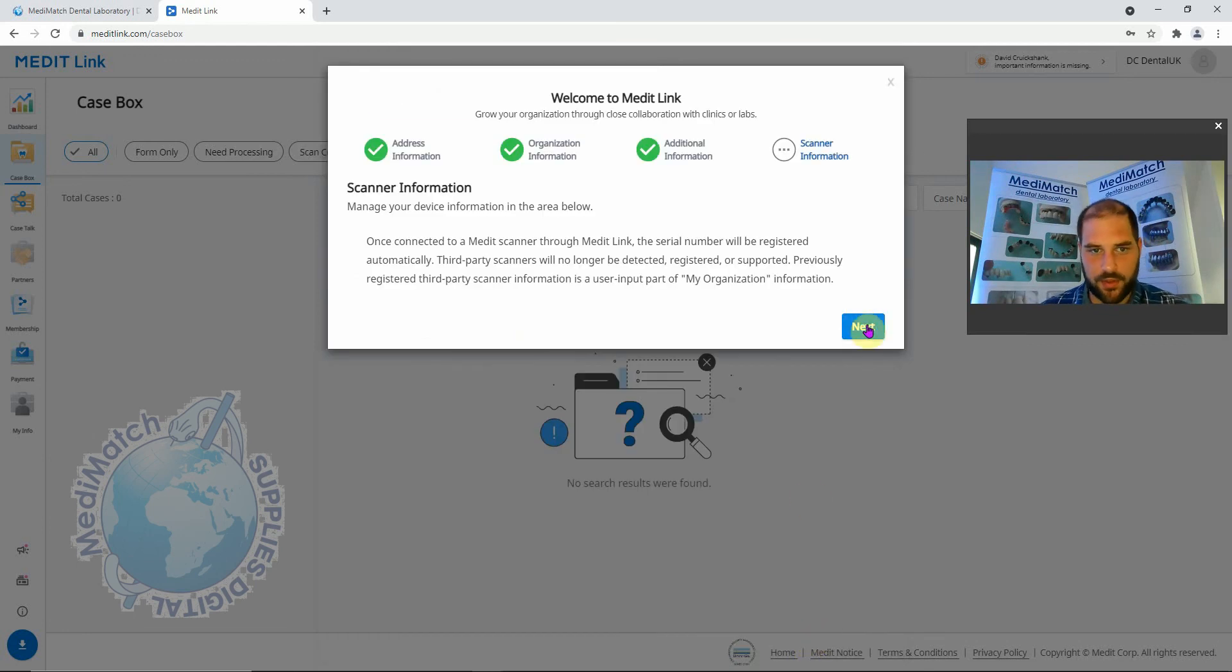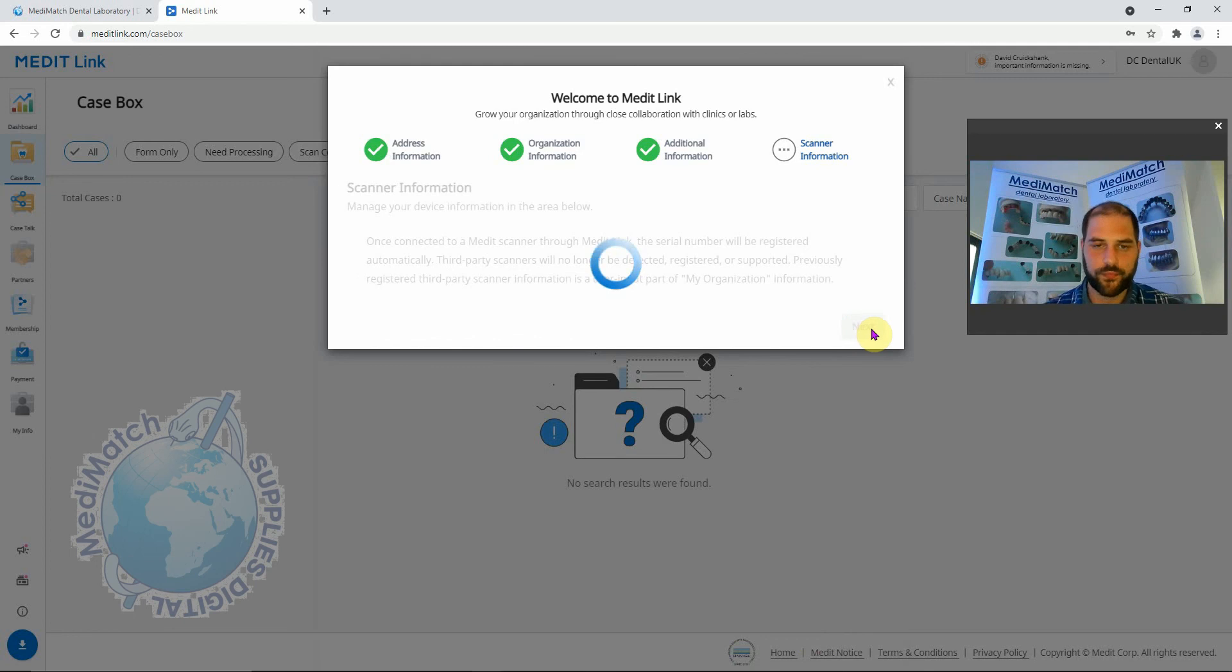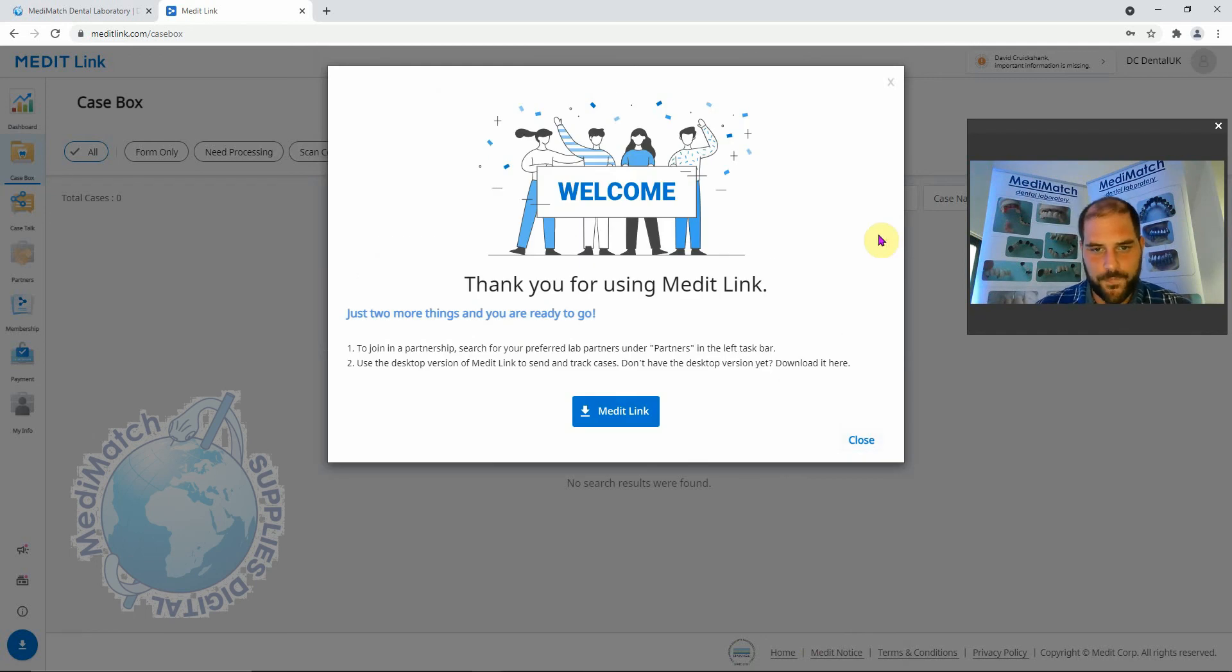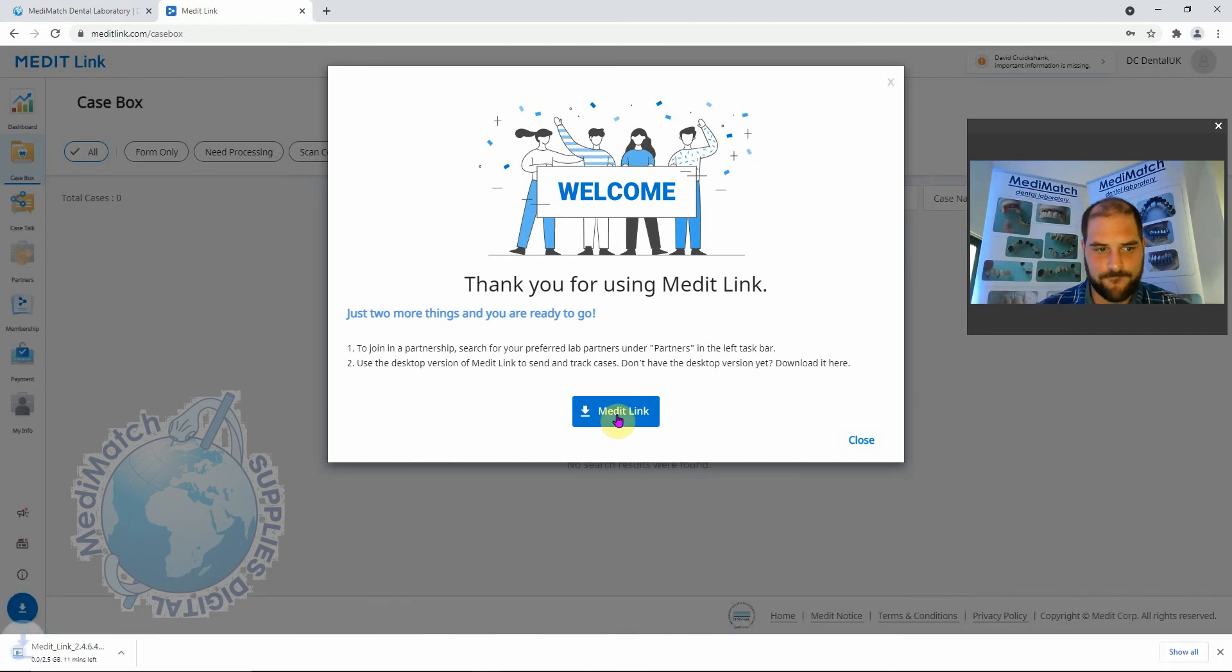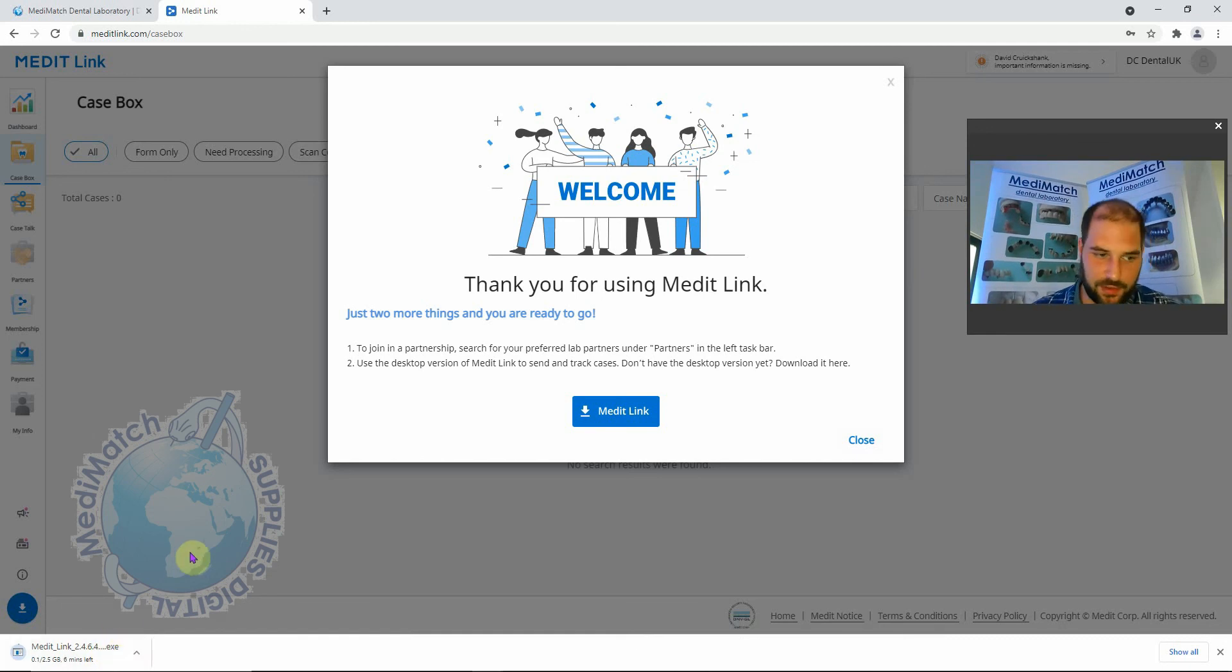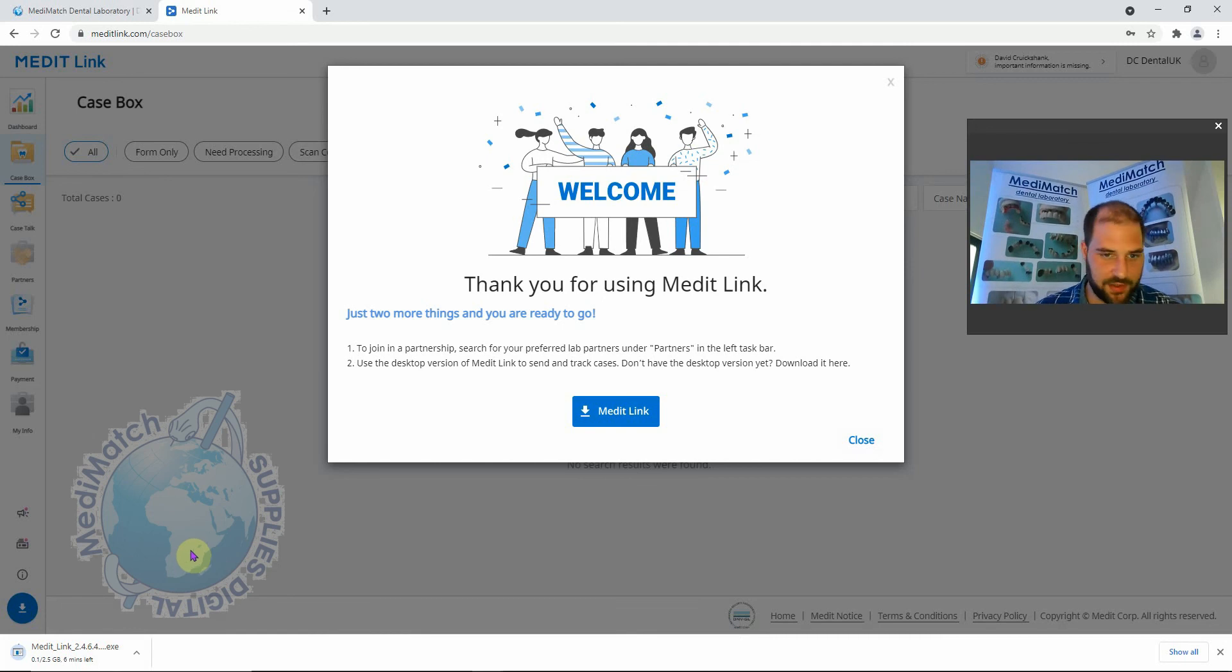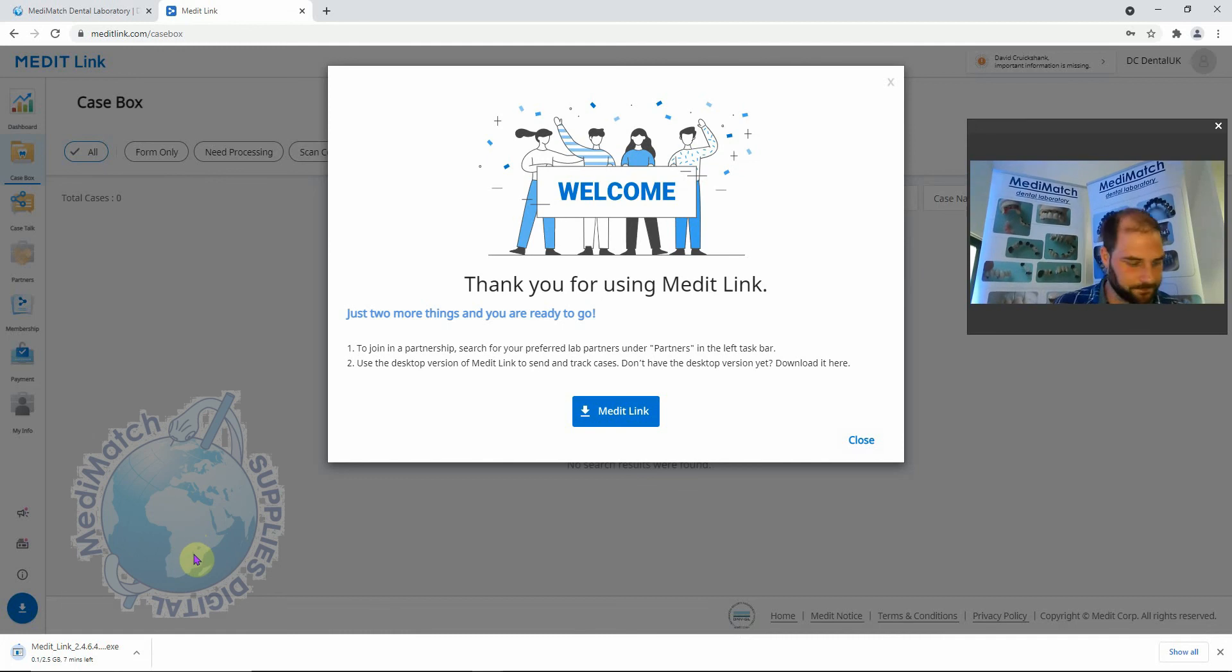We're pretty much done. We can now click on this icon here to download MediLink. That's just started off the download for the latest version of MediLink. It usually takes around 5, 10, 15 minutes depending on your connection speed. So we'll let that download and I will pick it back up again when it's done.